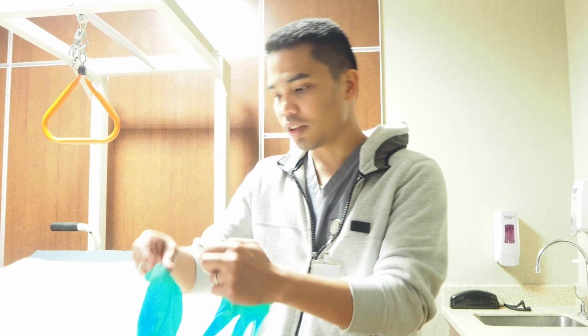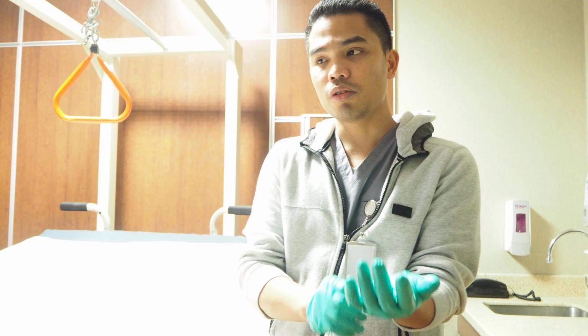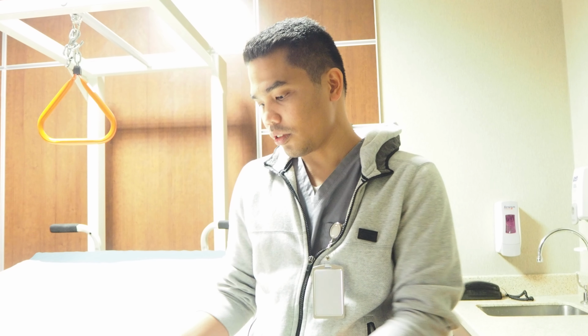wash our hands before that and wear appropriate PPE such as gloves, and then we always do our set of vital signs and pre-assessment. When doing those, every time we perform this therapy, it is really important to do auscultation, so that way we can observe especially the outcome for the breath sounds. Potential outcomes for this therapy are that it would help reduce any atelectasis, improve their breath sounds, reduce airway secretions, and also improve their laboratories such as X-ray.